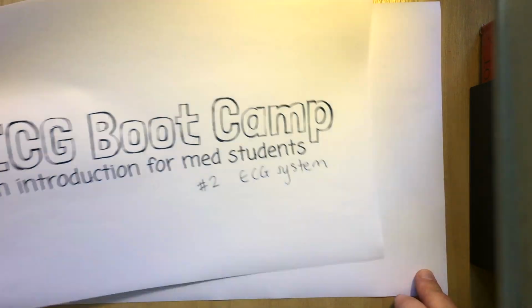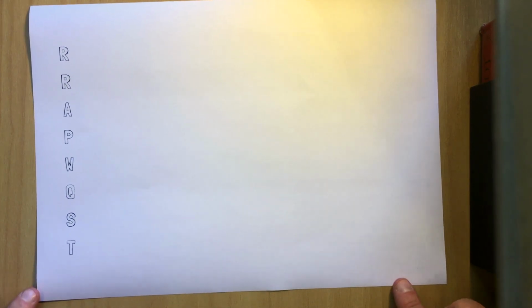So now on to the system itself. I'm sorry I haven't got any fancy mnemonics for you. This is just a system that they encourage in ECG Made Easy. I have slightly edited it to add an A in there for axis, but apart from that, it's just the letters and they kind of rhyme. So RRAPWQST, kind of a rhyme. And I just know that in my head now, and I know what it means as I work through an ECG.